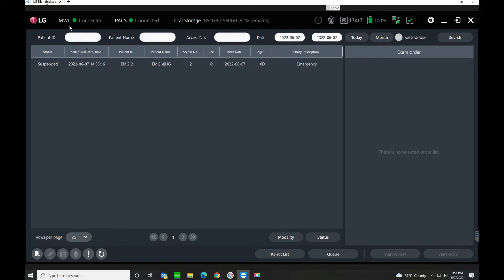If you're not familiar, modality worklist is referring to the connection between your DR acquisition station and your EMR or practice management system. The orders that are created at the modality worklist level are sent over to this machine and they build into this worklist right here. So if you had four or five different orders come through, you'd see four or five different patient studies lined up here.